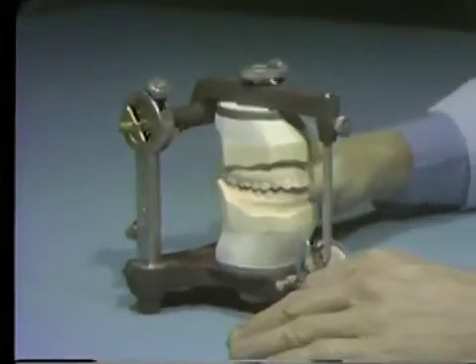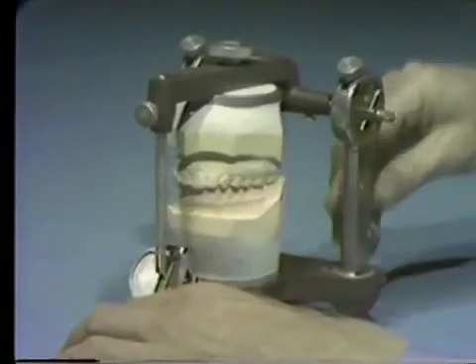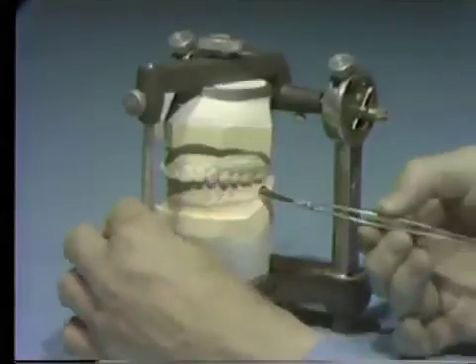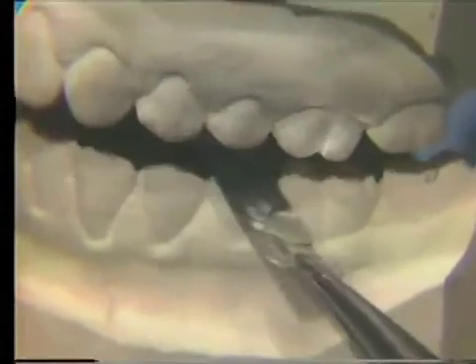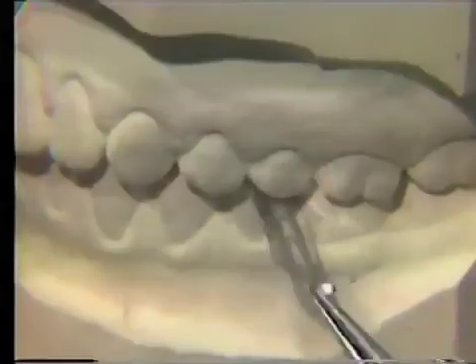Close the articulator and check with shimstock to verify which teeth are contacting prematurely in centric relation closure. The shimstock slides easily between the molars but catches between the second bicuspids. The clinical examination demonstrated a similar contact in centric relation. Notice the position of the centric relation premature contacts on the patient's first and second bicuspids. The marks from the articulating paper cover the wear facets, which are made by the teeth hitting in centric relation and sliding to centric occlusion.